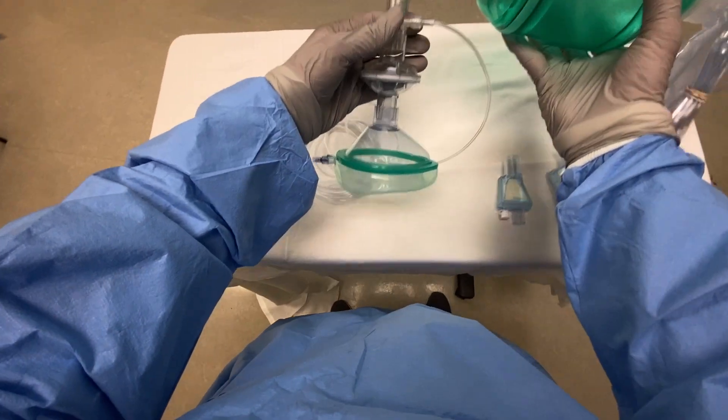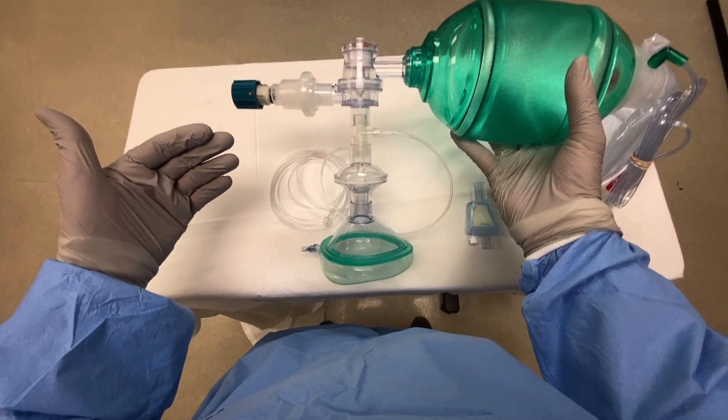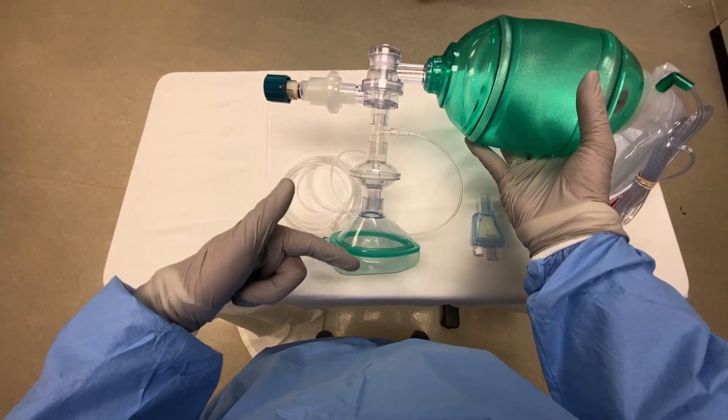Now that we have this all connected, we have a viral filter connected directly to the mask, and this will effectively separate inhalation and exhalation. So on inhalation, oxygen flows from the bag and the reservoir into the patient. On exhalation, it flows in this direction.